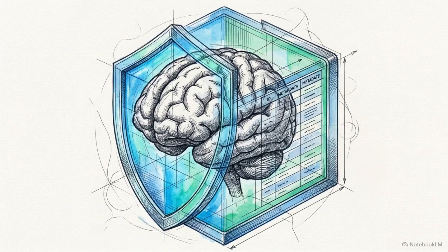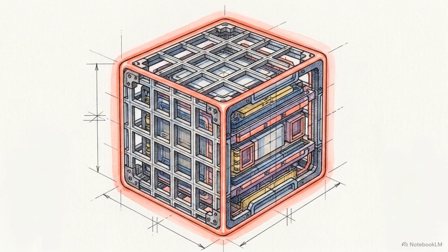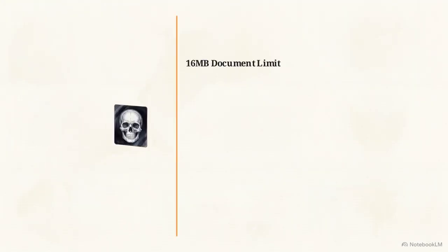High-stakes healthcare systems require a database engine that manages both the file metadata and the physical binary payload within a secure, unified boundary. Modern NoSQL document databases, like MongoDB, use specific engineering methods to meet this unified storage requirement. MongoDB's architecture enforces a strict 16-megabyte size limit on individual BSON documents. Since an uncompressed MRI scan can easily exceed 50 megabytes, it violates this limit immediately. MongoDB bypasses this constraint using GridFS.